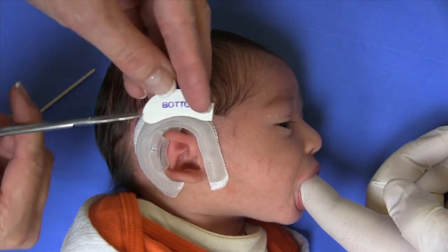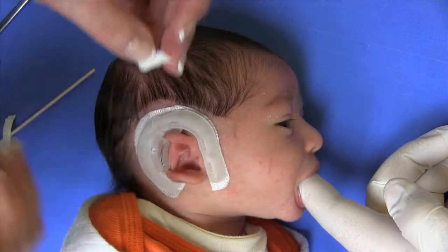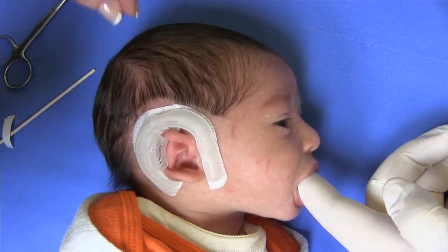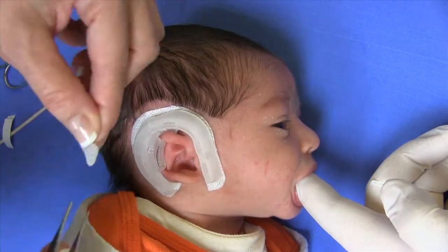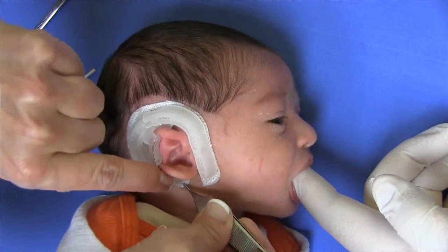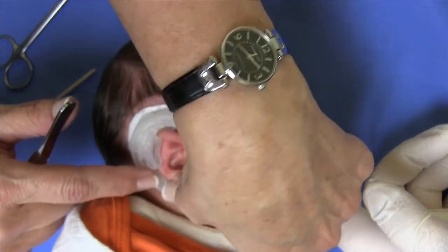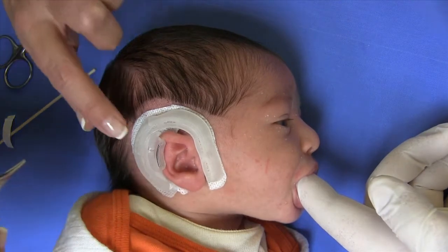So what I have is one of my bottom tapes, and I'm just going to trim that so it fits behind the ear — we have a double sticky tape. We'll just place that behind, and that gives us just a little bit of extra tension on that area, so it's pulling everything all the way back. You could also put another piece of tape over the top of this, which we'll probably do at the end.